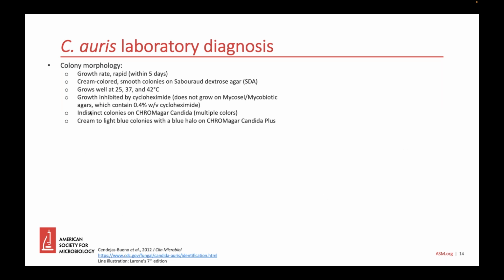What about diagnosis of Candida auris? What about the colony morphology? So it's a rapid grower. The colonies are kind of nondescript on the colored agar.